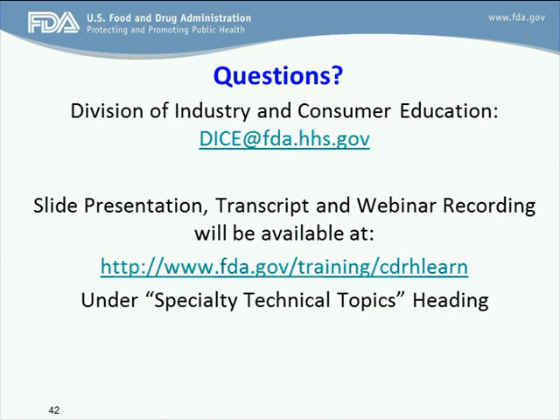validation. Okay. The only reason I asked the question is the objective is really to make sure the microbe load is low enough so that when you do disinfection, it will be expected to be effective. But I understand the comment that you made. And the last question I had was, I noticed that when you were talking about the Spalding classification, you have categorized bronchoscopes as semi-critical. Could you expand on that a little bit, given that they do enter a sterile body site in terms of going into the lungs?